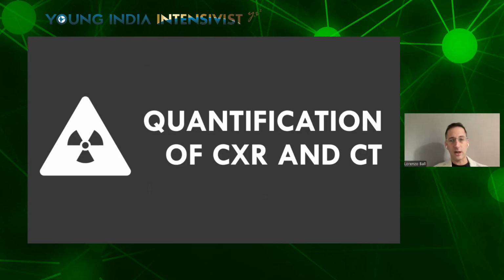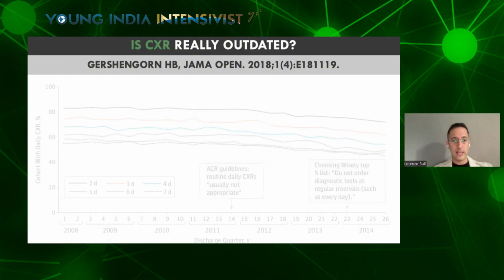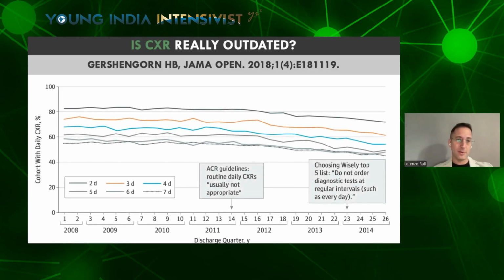And I would like to start from the good old chest X-ray. We should ask ourselves whether chest X-ray is really outdated. And the short answer is no. Look at this paper from JAMA Open. It is a case study in US hospitals.